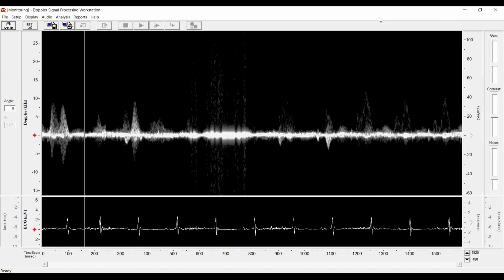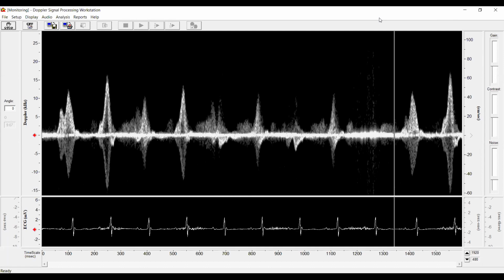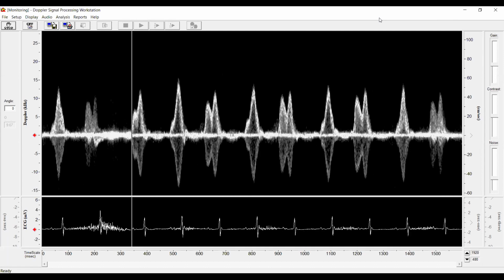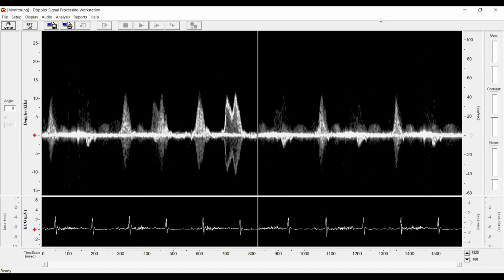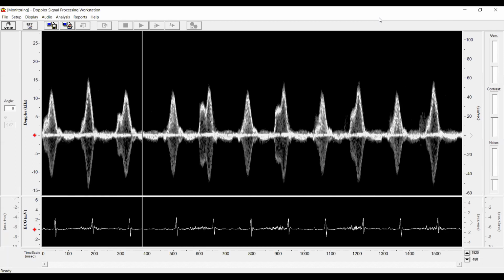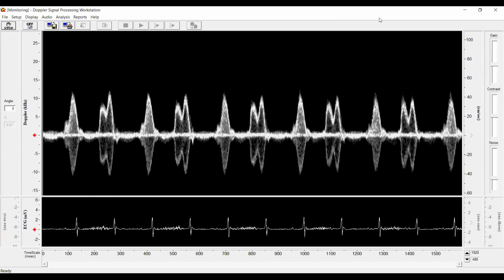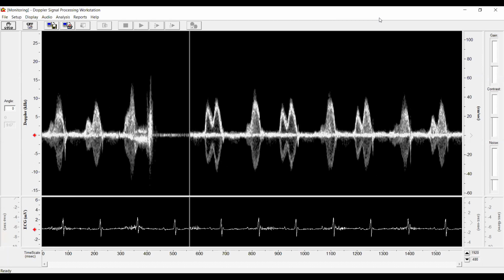So again, we're at a local lab, so this is not necessarily a strain that we're familiar with. The E peak is very low, if that's the mitral valve. It's where I would expect the mitral valve to be.